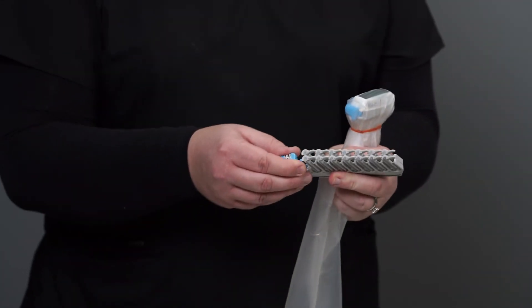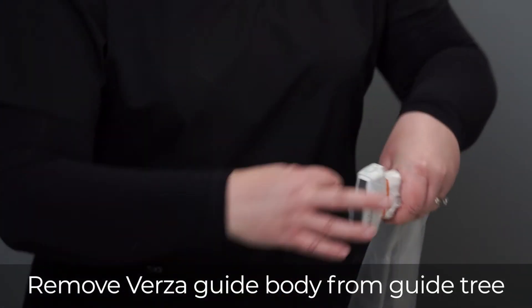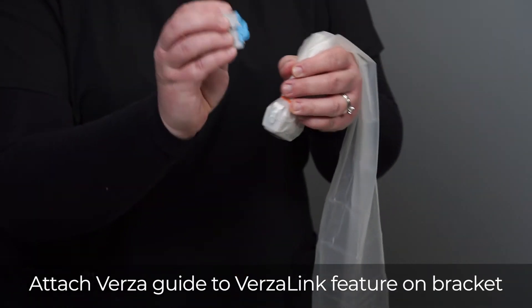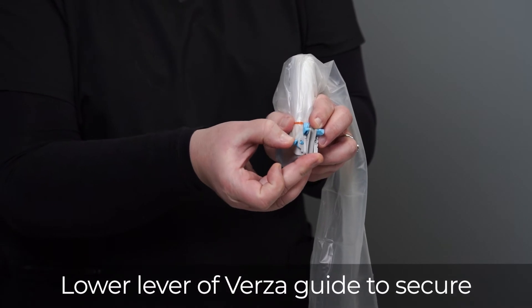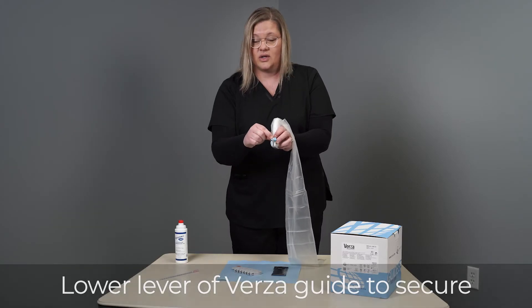The next step will be to take your Versa guide body off of the tree and apply it to the Versa link. The Versa link feature allows the guide to attach directly to the bracket. Once you have it situated, you'll lower the lever and your guide is fastened securely on.